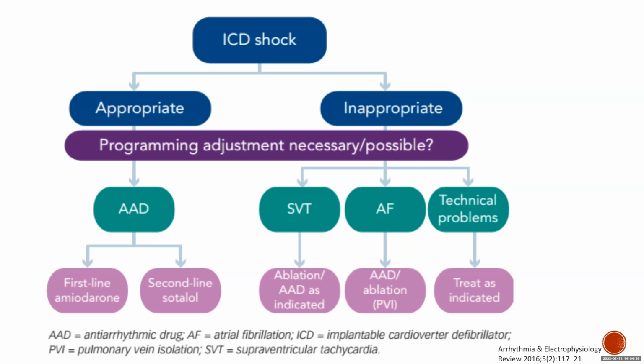And if the patient is awake, so sometimes, not common, but sometimes if you have lead fracture, for example, the patient will present with ICD shocks. These are really painful, and the patient will keep receiving shocks. So what you do, you put the magnet on the device, which will inhibit the shocks, and then you decide if the patient needs shocks or not. In the case of lead fracture, patient does not need. So you prevent the patient from receiving multiple painful shocks.